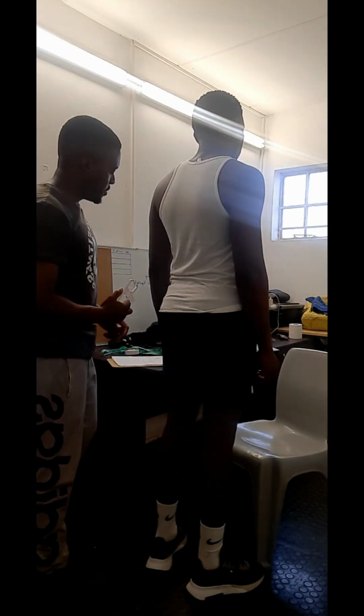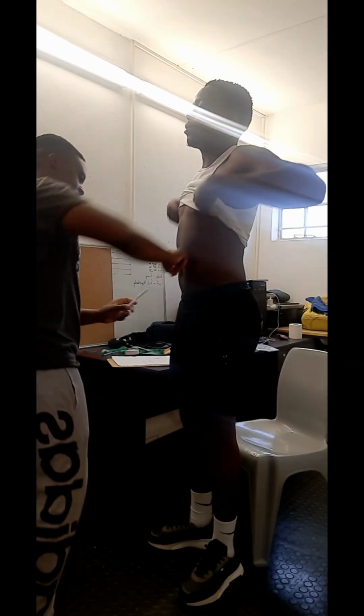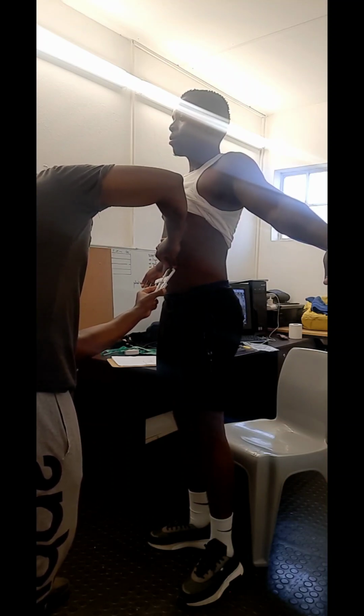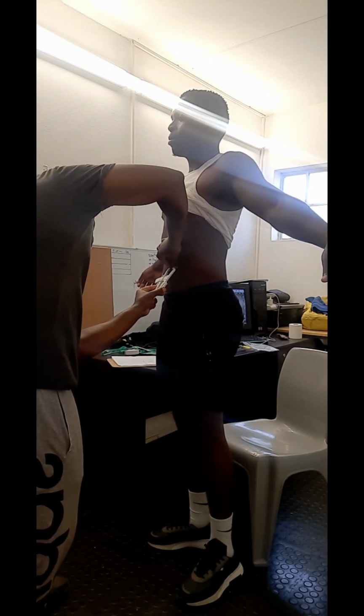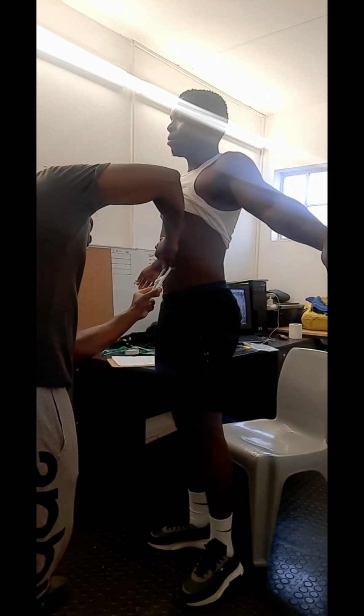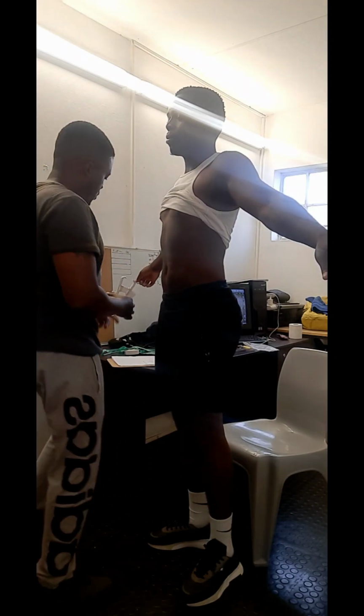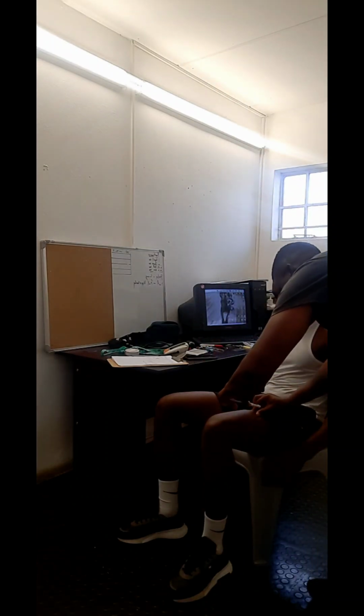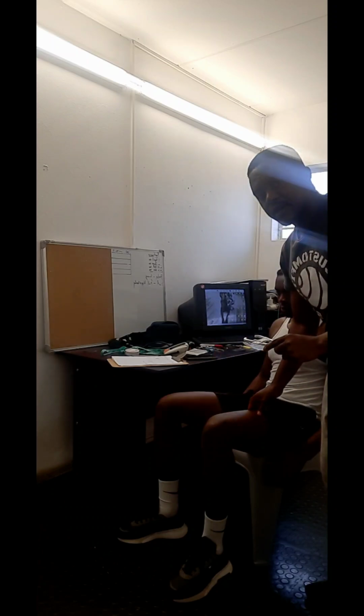His triceps measurement is 10 millimeters. His abdomen measurement is 15 millimeters. His thigh measurement is 13 millimeters.